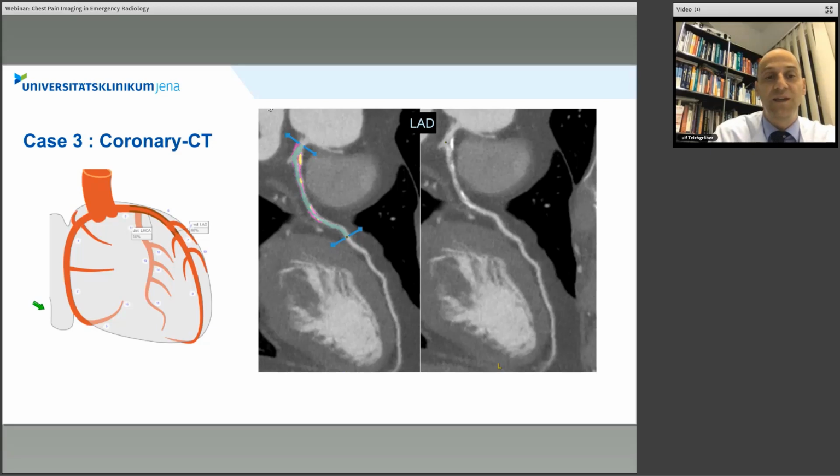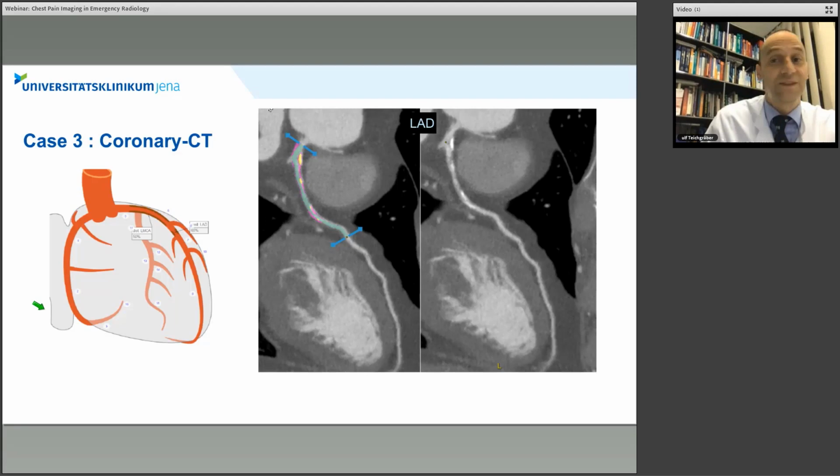And the additional information we can give now to our cardiologists is also the plaque analysis of whether it's soft plaque or hard plaque, which is always quite difficult in the coronary angiography. And we also use the same terminology as a cardiologist, by the segments. This is the way you should really communicate with your cardiologist, in the same language that they use, and also try to give them some additional information which they do not get from their invasive coronary angiography, by plaque characterization.